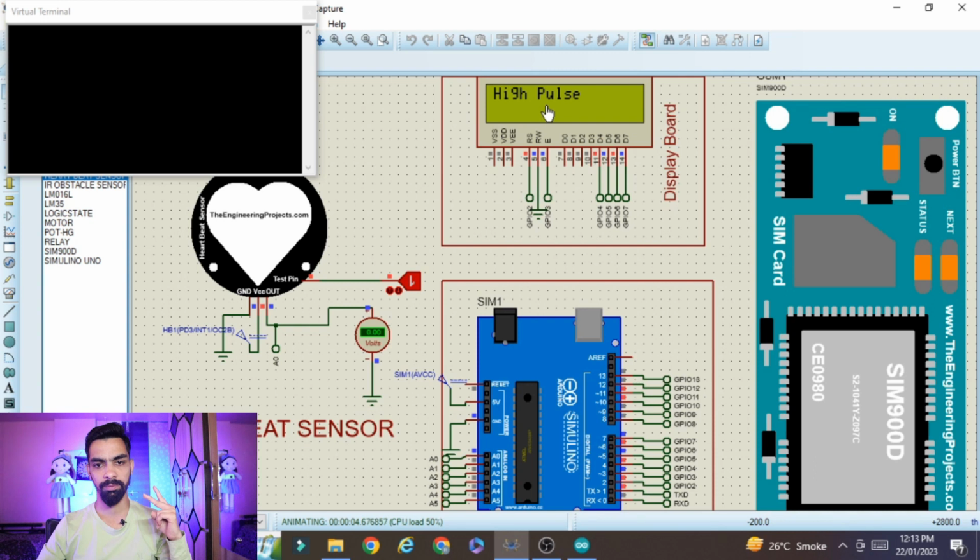then second high pulse detected right now. Now third high pulse detected. Fourth high pulse detected. Then fifth high pulse detected. Then sixth high pulse detected. Now I will turn off this one. So right now we detected the 6 high pulses.